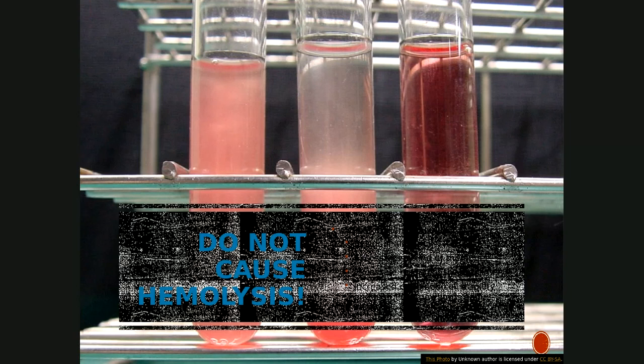We do not want to cause hemolysis, which is the breaking apart of red blood cells. It is really, really essential. So this is just various degrees of hemolysis. This would be slight hemolysis, and then this would be gross hemolysis.